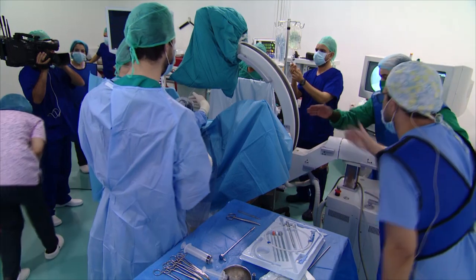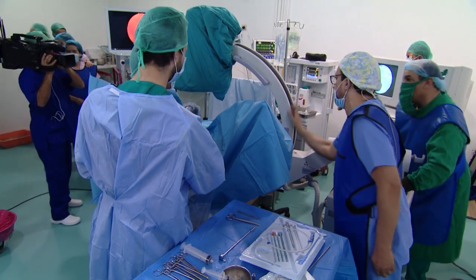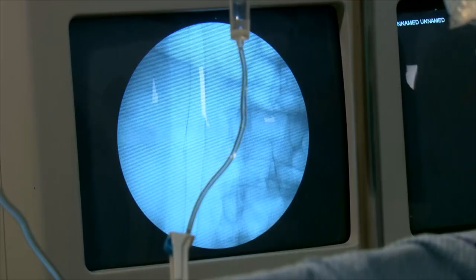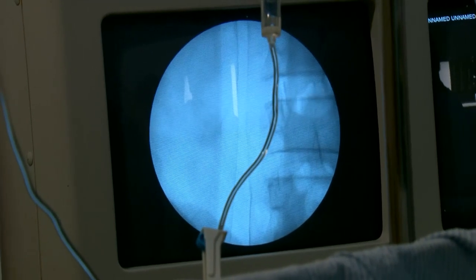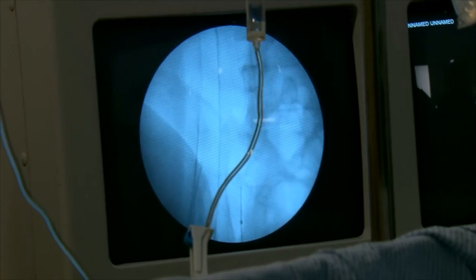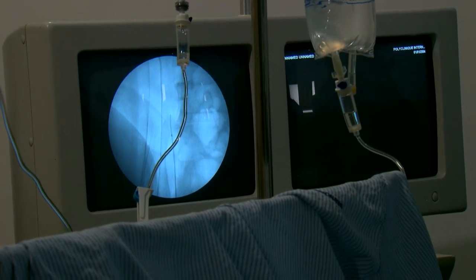Okay, lower, small pelvis. No, right side. Now, towards me. No, more down. More. Okay, let's try. Yes. Now X-ray, please. Little X-ray. More X-ray. Press the button, please. Keep pressing. Continuous. Okay. Stop.